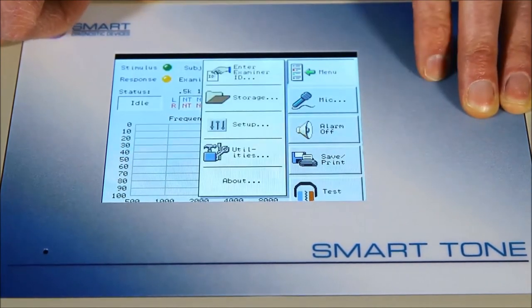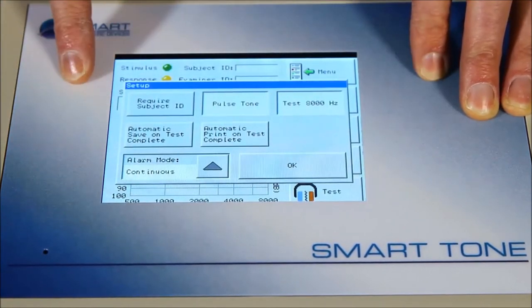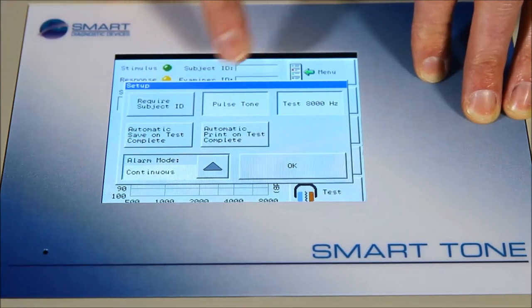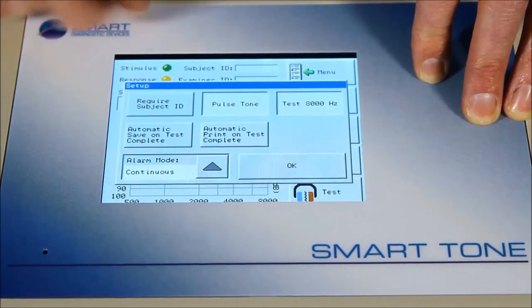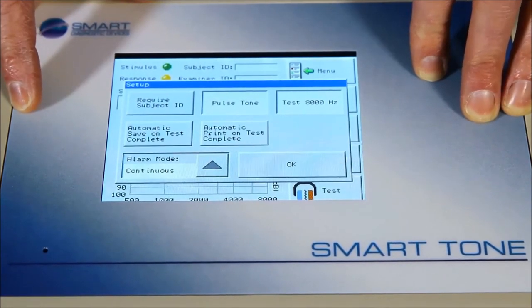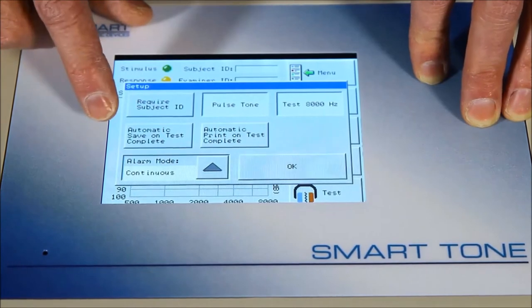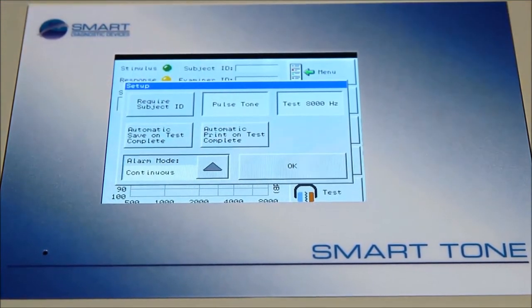Back to the high-level menu, we can also look at the setup of the device. As you can see here, there's the options of how you want the machine to perform. In this case, we've selected Pulse Tone, and we're testing all the way to 8,000 Hz. You could turn that off if you wanted, or go to a constant or continuous tone if that was required. You can also key in here that you want to automatically save every test when it's completed, or print if we're connected to a printer.